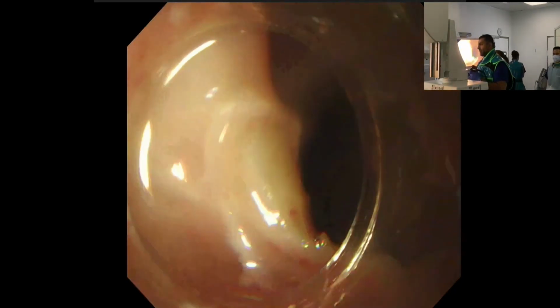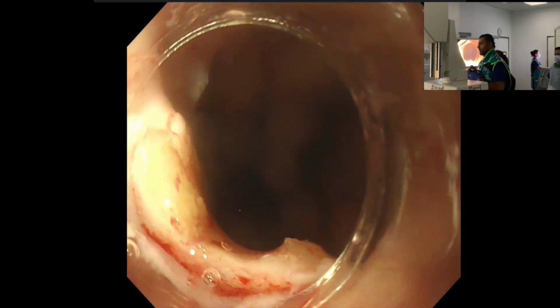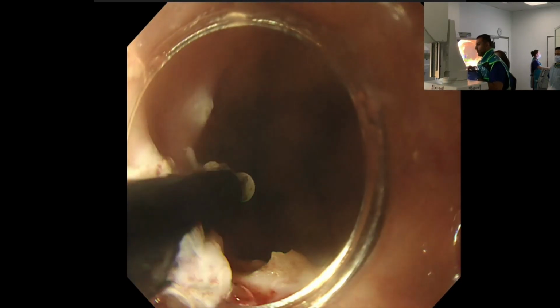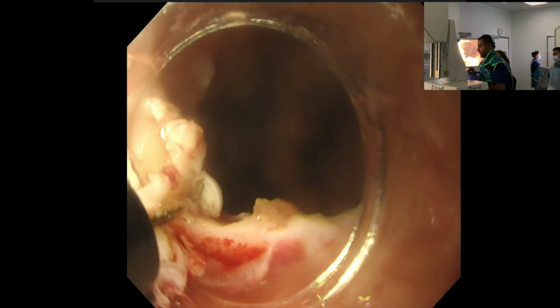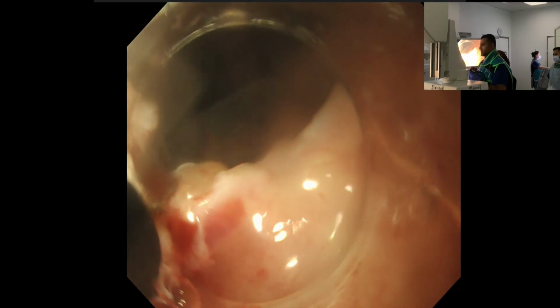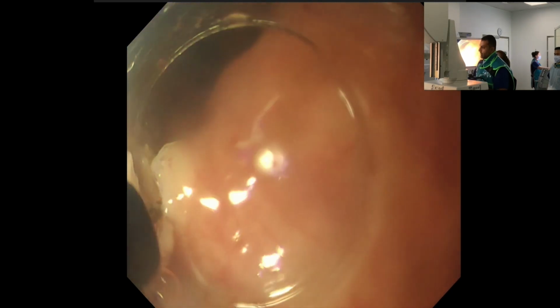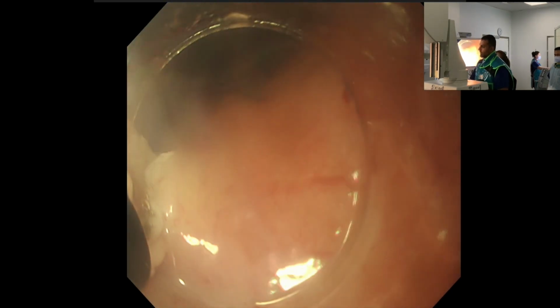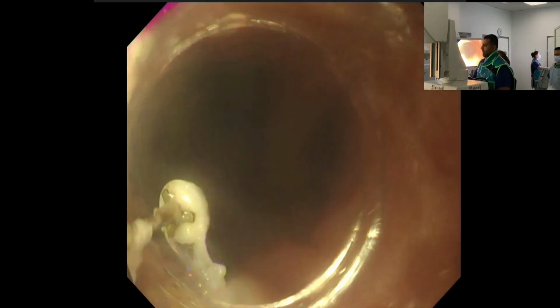So you can see just how fibrosing it is there, that even with that first incision, we're still not seeing muscle. So I know I'm safe here because I've got an insulated tip, and we're just going to use that same circular motion again just to get a little bit of depth, and then just slide under that mucosal bridge to carry out a circumferential, almost like a mucosotomy you would do for ESD.